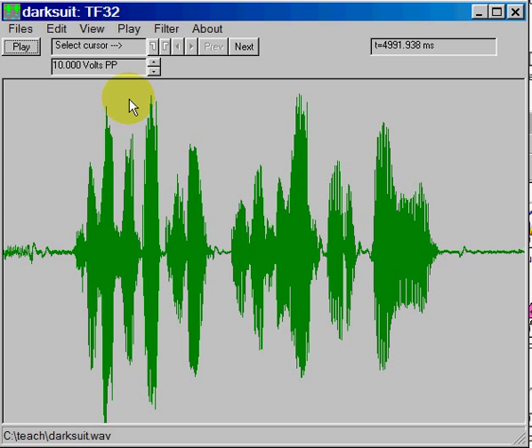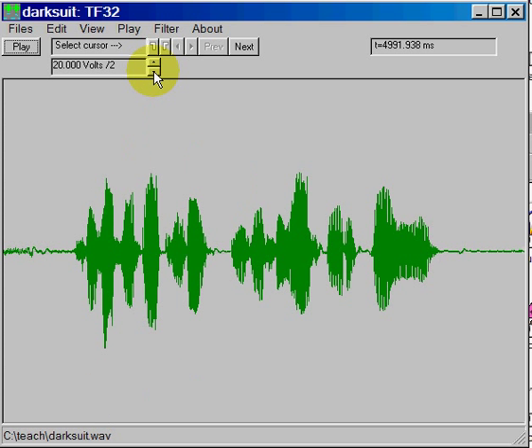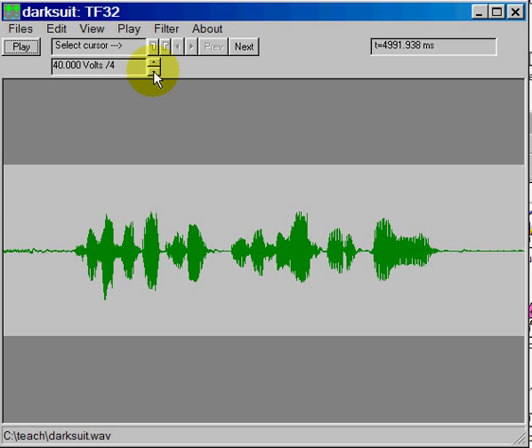One is the amplitude of the waveform, and we control that by simply using these little up and down arrows here in this portion of the menu. If I press this button, it will make the signal smaller overall just by scaling it down.